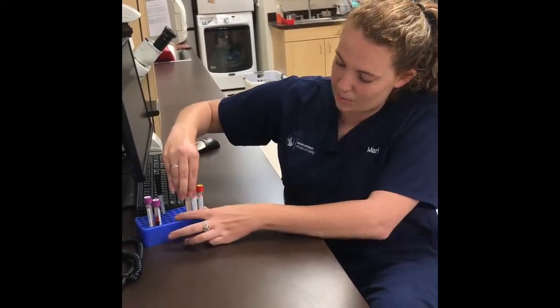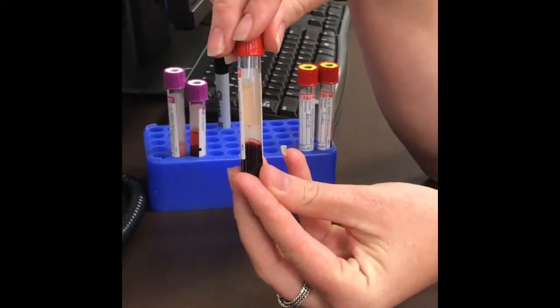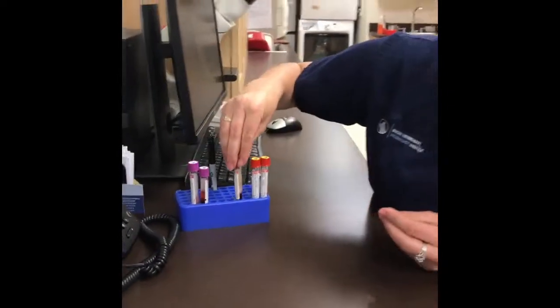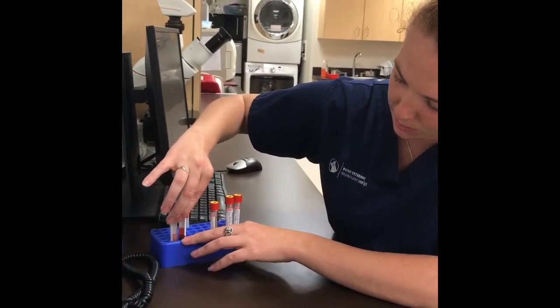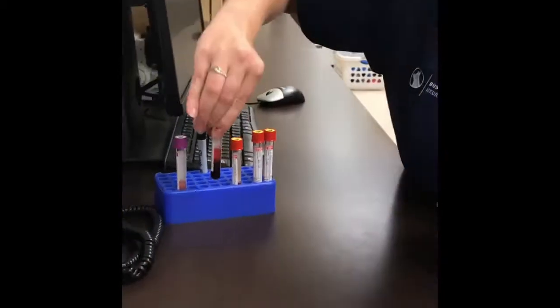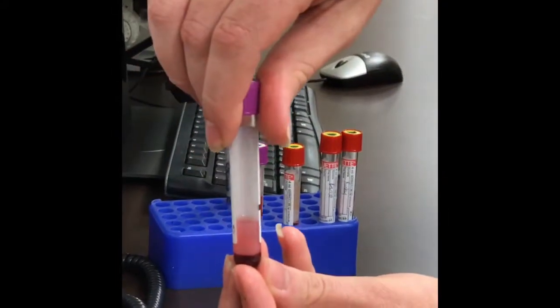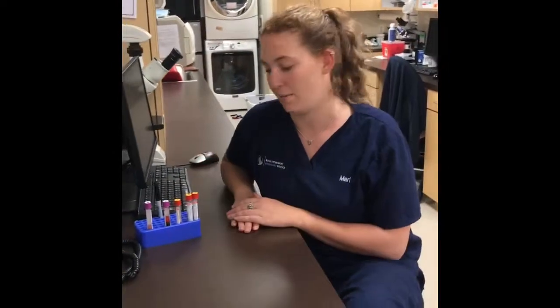I've got an example of a clean serum sample here. So it's nice, clear, and probably straw colored would be a good term to use. Okay. And then we've also got a couple samples of our plasma. So we've got a hemolyzed plasma sample. And a mildly lipemic plasma sample. Okay, and that's the end of our plasma and serum collection techniques.